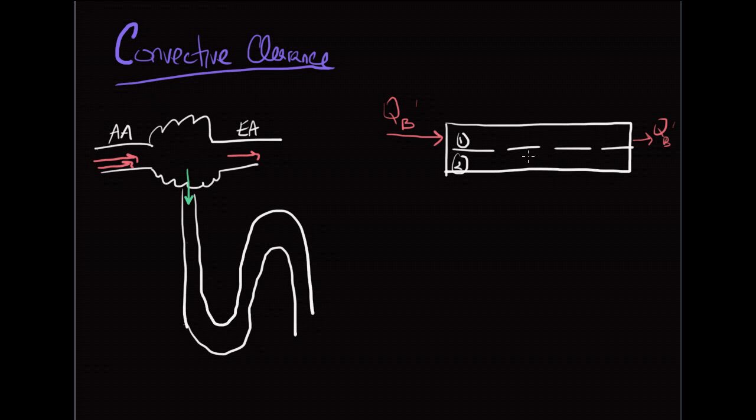You notice that in this filter I have not done anything to compartment number 2, because what's happening is you're not having diffusion in compartment 2. There is no dialysate fluid going in the opposite direction. Your machine is applying a pressure at this point right here that's greater than the pressure it's applying at this point right here. The difference in that pressure is going to force the fluid that's in the blood into compartment number 2 and then out as waste. That's how convection works.